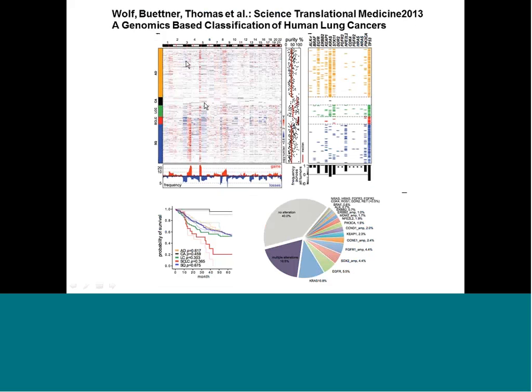And by only this one dimension of genomic information, you can immediately classify all adenocarcinomas, all squamous carcinomas, and the group of not otherwise specified unclear tumors are being nicely classified into neuroendocrine tumors, into large cell neuroendocrine and small cell cancers. And besides this, there are oncogenic driver lesions, which are specific for all these tumor entities.